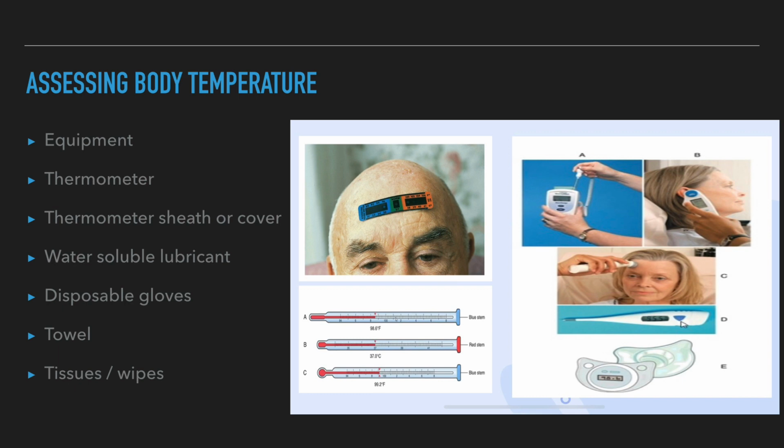On one brand, a green N indicates a normal temperature, a brown N indicates a transition phase, and a blue-green F indicates an elevated temperature. The transition phase reflects the onset of a high temperature in the area where the strip was placed. The strip is removed and discarded after the color change has been noted. This method is particularly useful in the home. Because children younger than 2 years still have immature thermoregulatory systems, any variation from normal should be confirmed.